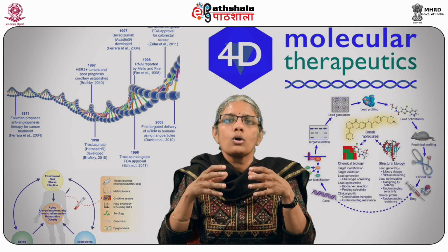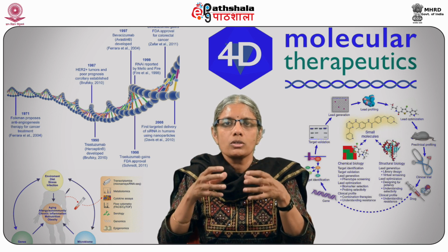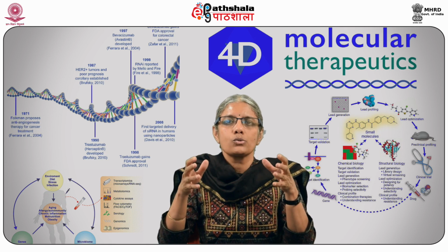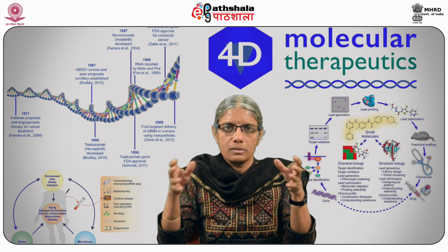We also understood the importance of a buffering system, which in most of the mammalian culture systems is the bicarbonate buffer, for which an external source of carbon dioxide is used, which is usually 5 to 10%.